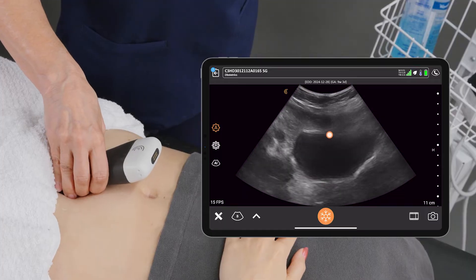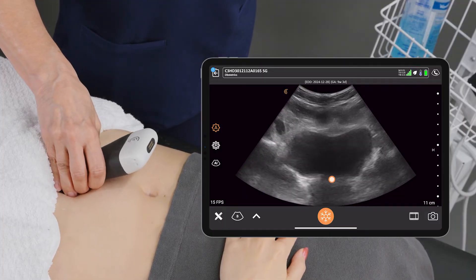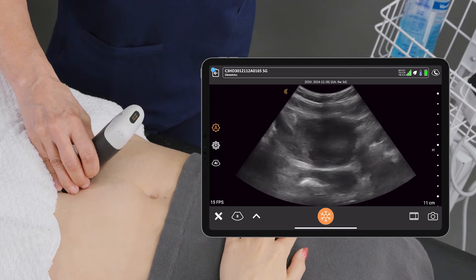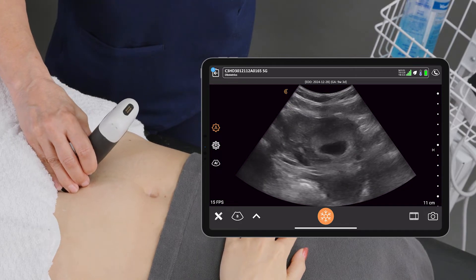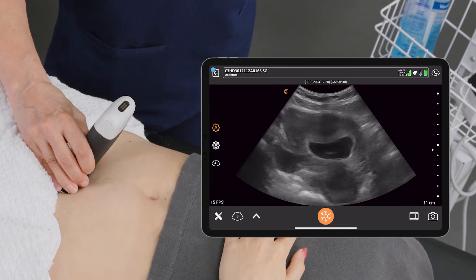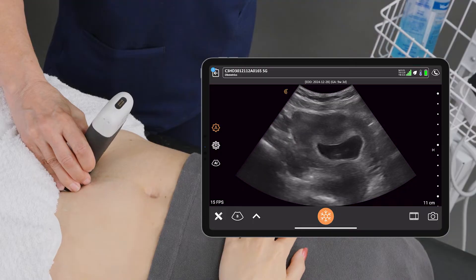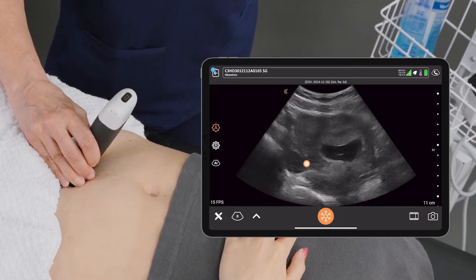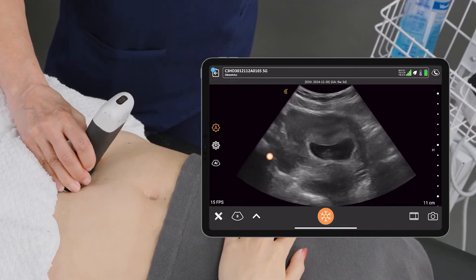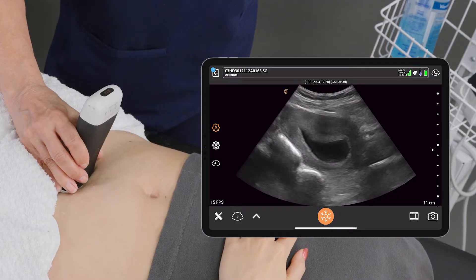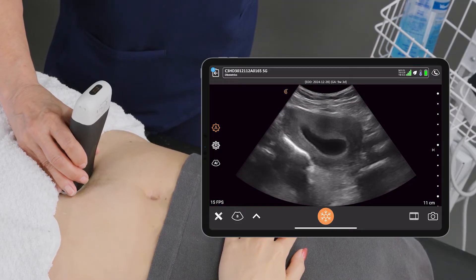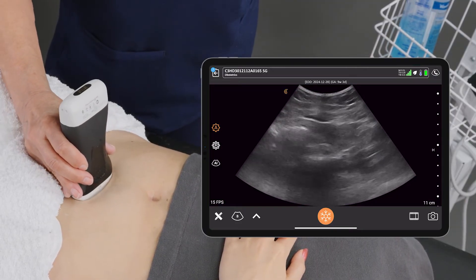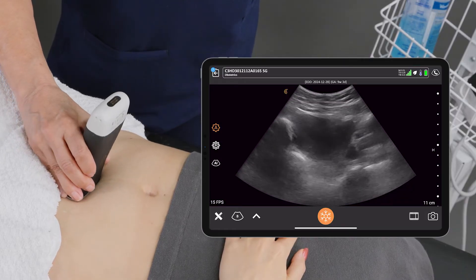So I'm scanning low. This is the bladder just behind the pubic bone, and then we can slowly scan up. I'm seeing the right ovary there with possibly a corpus luteum cyst, and we can scan all the way up to the pelvis. We've definitely confirmed that there's only one baby there.